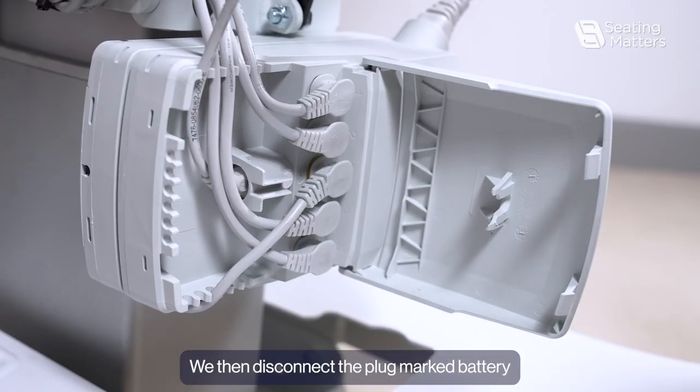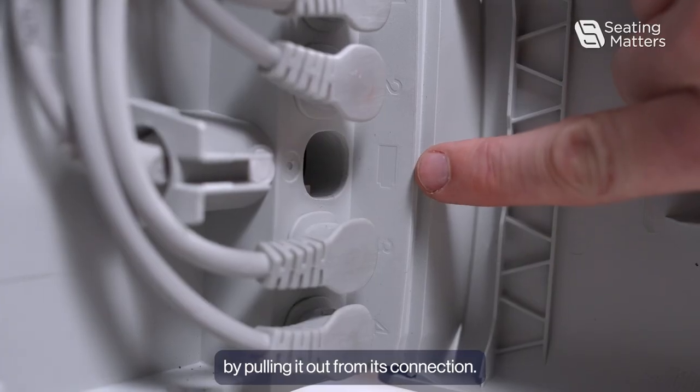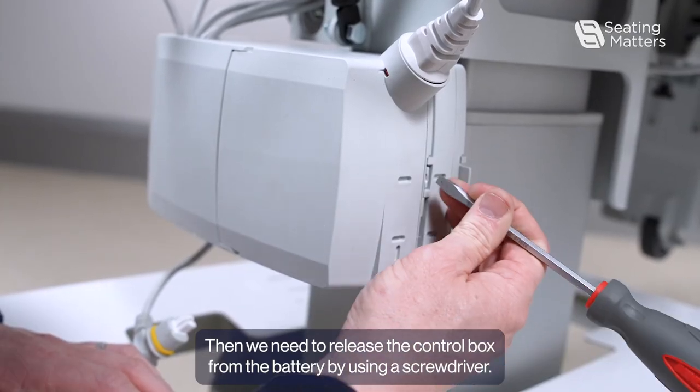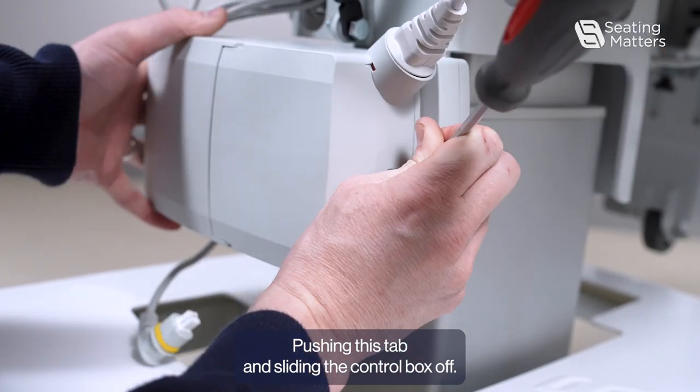We then disconnect the plug marked battery by pulling it out from its connection. Then we need to release the control box from the battery by using the screwdriver, pushing this tab and sliding the control box off.